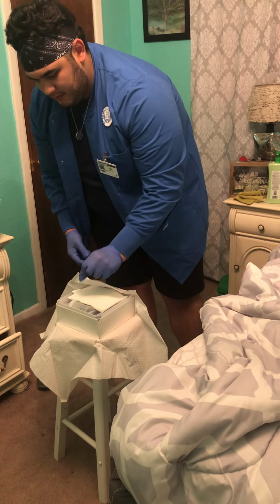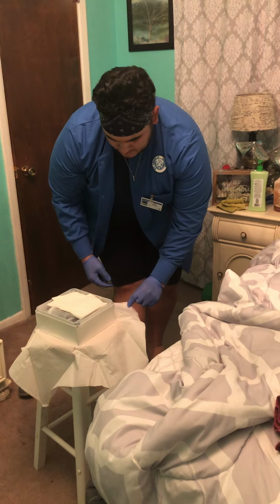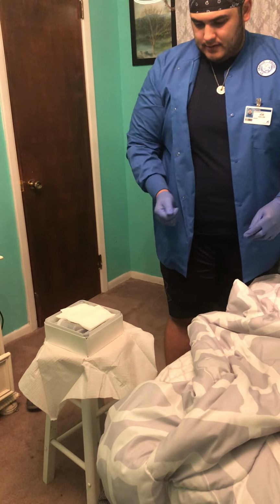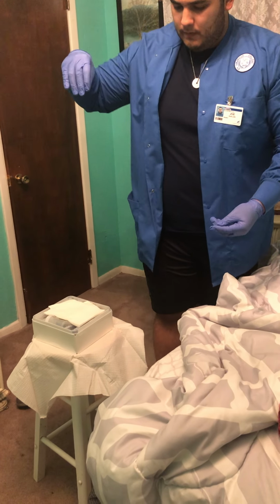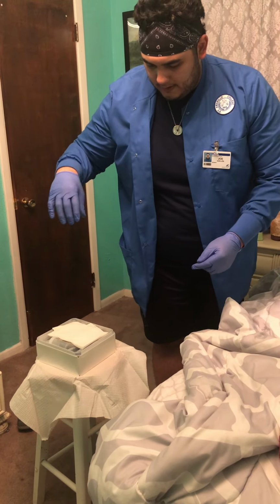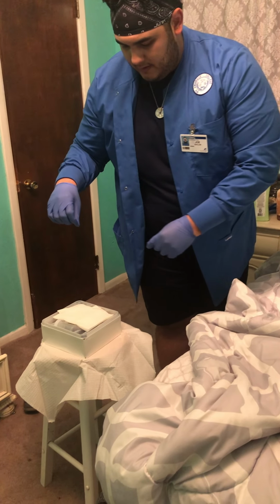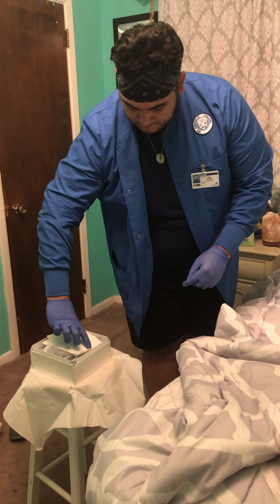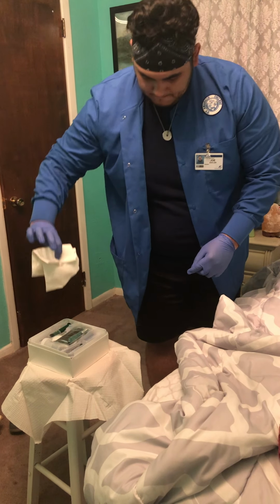And then the last flap would come towards you. Alright, so now that we've gotten to this process, you want to kind of come over to your working area, and you want to grab the drapes and the pair of sterile gloves only, like so.